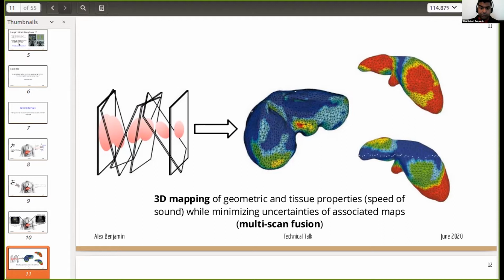And so this allows you to compare the organ as a whole at time point 1 and any subsequent time point. The utility of 3D volumes becomes very clear on this slide, because if this were a fictitious property map, you can see that it's definitely not uniformly distributed. And depending on where you acquire the image, you're making a very different diagnosis.